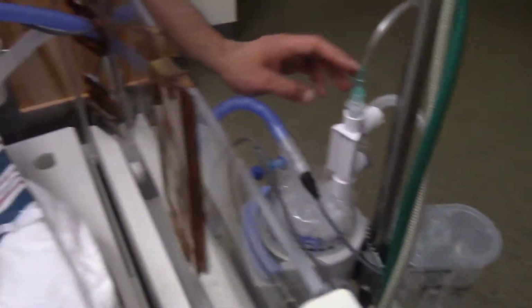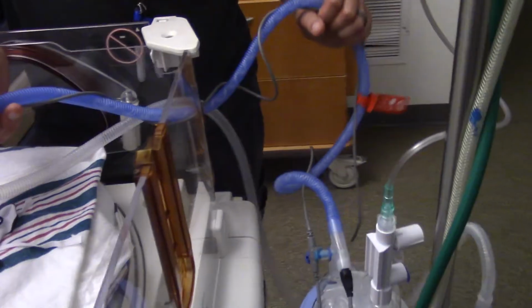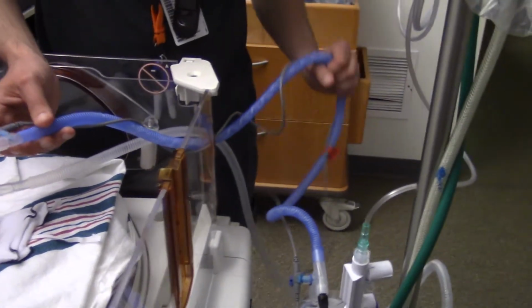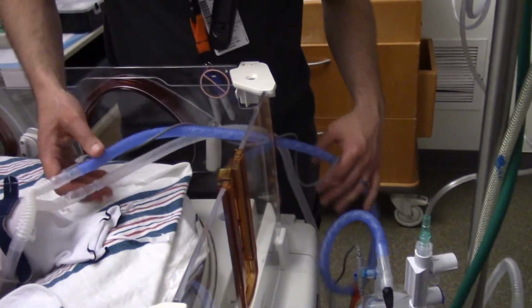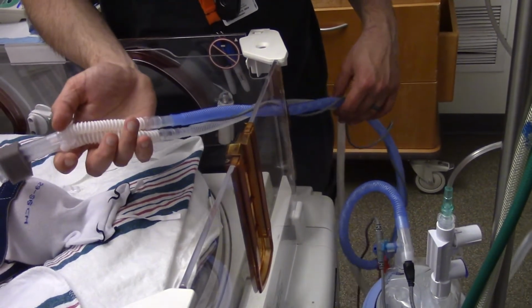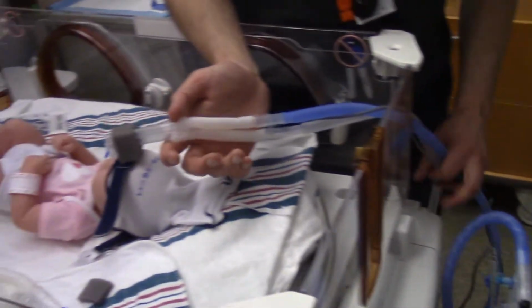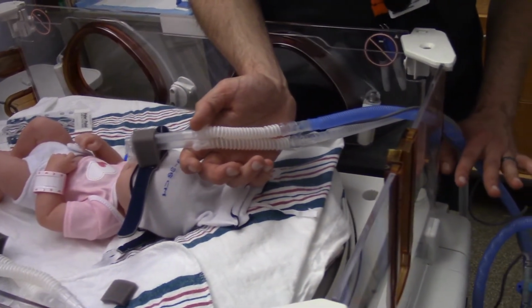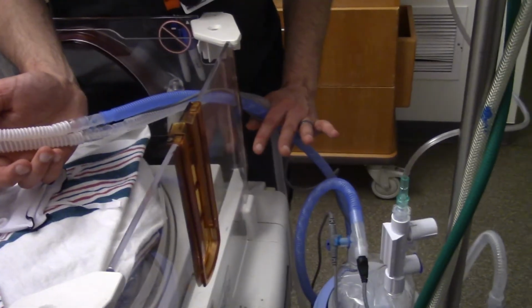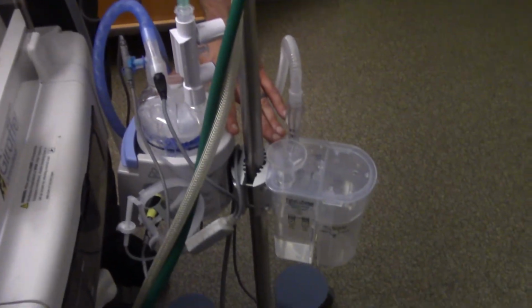Okay? One thing that does help with that, making sure that we, on our checks, are making sure there's no stagnant water in there, that everything is level and elevated, and we have the low point down below the actual patient. Okay? Touching on that note, we want to always ensure that our bubble CPAP and our heater are below the patient as well.